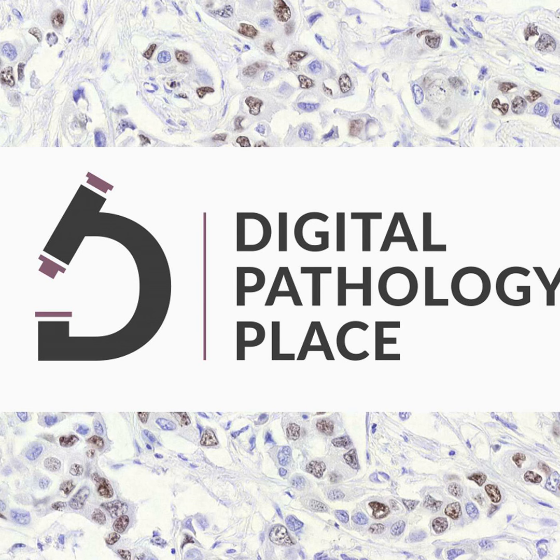So this domain shift, or different domains, are exactly like the cohorts of slides that are similar because they were stained in one batch, and then a different batch was a little bit different. So you have this staining domain shift, or it was a certain population, then it was deployed on slides from different populations, and it didn't perform quite as well because the domain was shifted. So this actually accounts for the domain shift. And CHIEF provides a generalizable foundation for efficient digital pathology evaluation for patients with cancer.